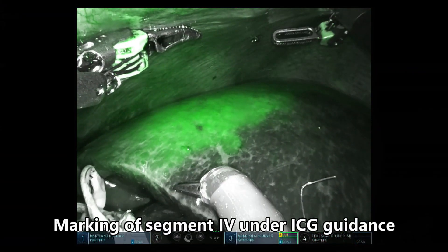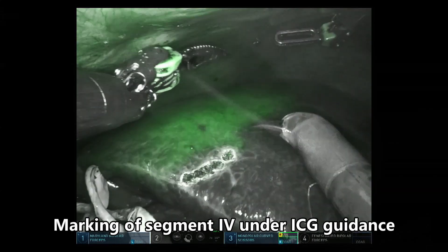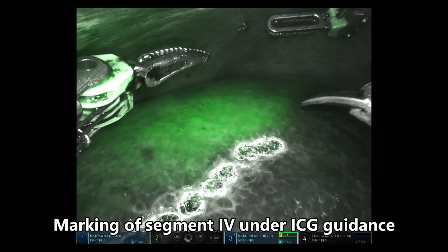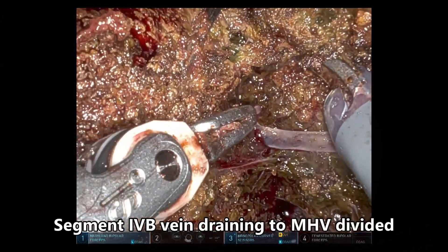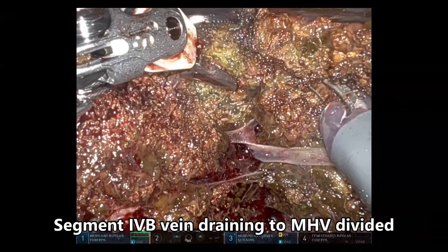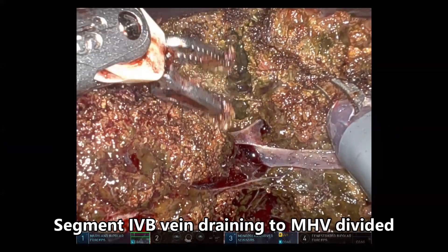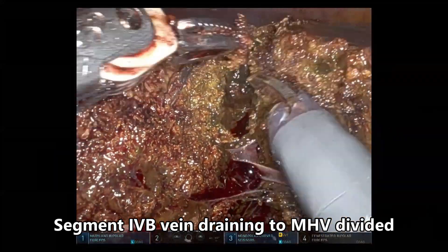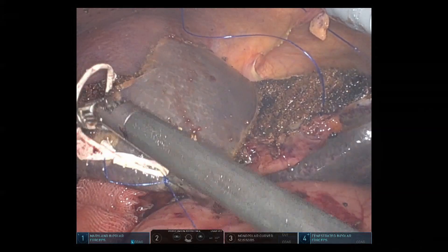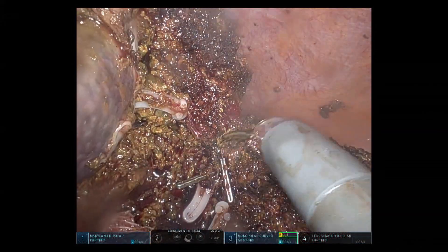Under ICG guidance, the boundary between segment 4 and segment 5 is marked. We can observe the segment 4b vein draining to the middle hepatic vein, which is divided to facilitate the segment 4 resection. Segment 4 resection is completed.